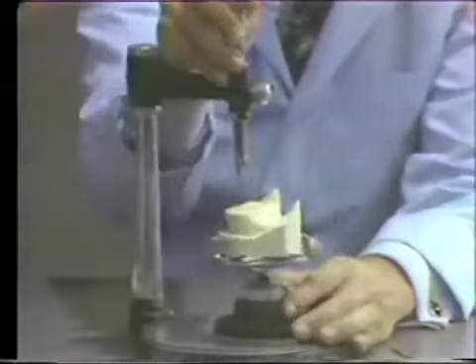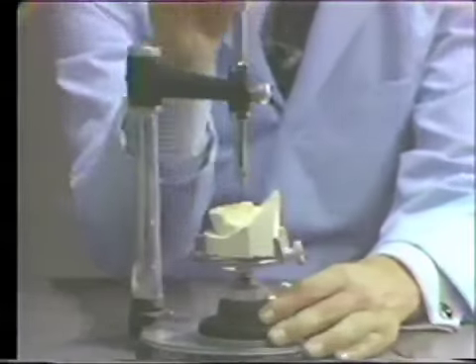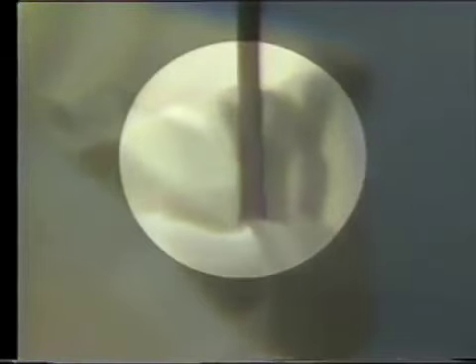Now we'll also go to the buccal surface of that tooth and see what we have here. The buccal surface of the molar tooth is less likely to have an undercut, and we find this is true in this case with the cast in this position.